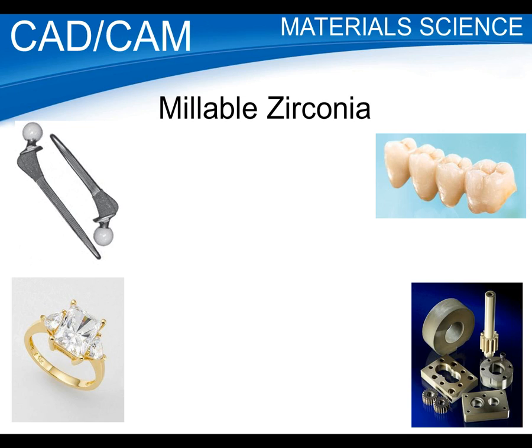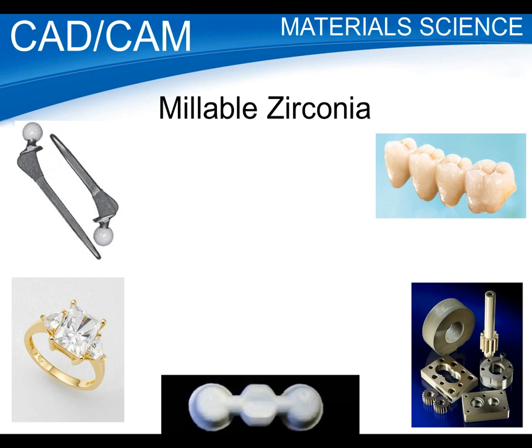We could take this 4-unit bridge that you see, take it out to our shop, run over it with a forklift, and it wouldn't have any negative impact. Now, why hasn't it been used more in the past? Well, it is so strong. It's very hard to machine. Goes through tools like crazy. So in its sintered hard state, it's very strong but very hard to work with.